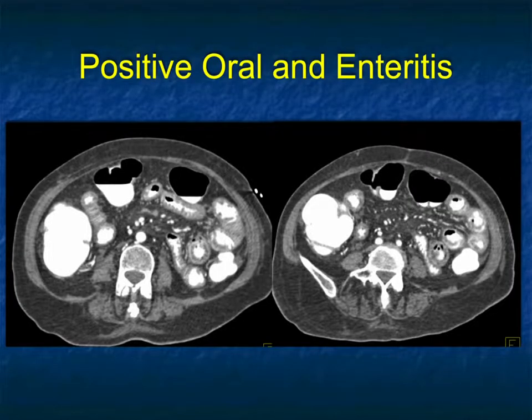Now, other things we can do involve the small and large bowel. But let's do this. Let's stop here. And let's pick up the colon and small bowel when we come back in a few minutes.